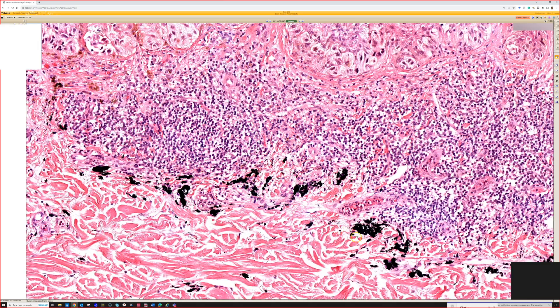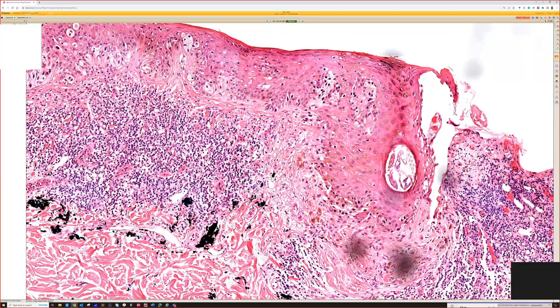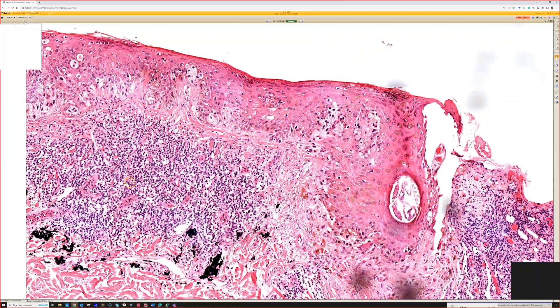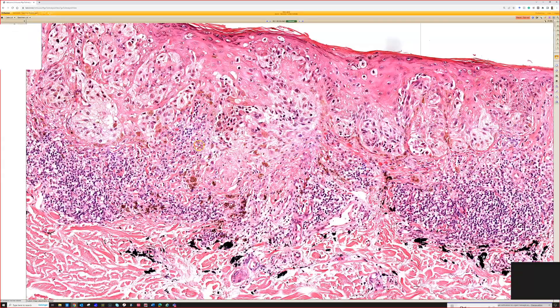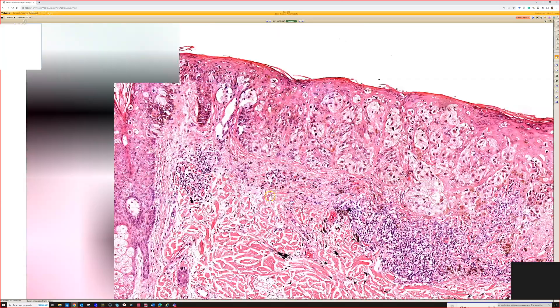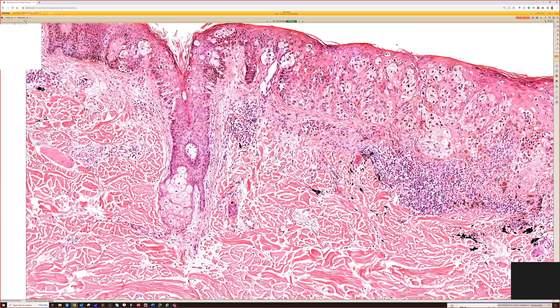I have encountered people who misunderstood this. I once heard someone say you shouldn't use black surgical marking ink to ink the margins on a melanoma specimen because it would be hard to tell apart from the melanoma. But that's not true, because melanin is not black — melanocytes are never black. They are brown when they're making pigment, and a lot of times they don't make any pigment at all. So there we go — that's melanoma plus a tattoo.